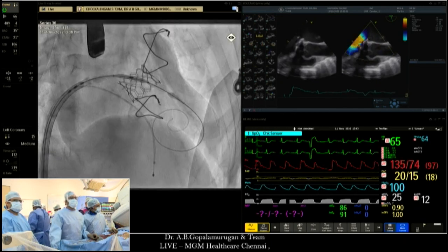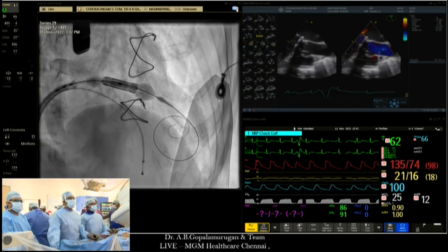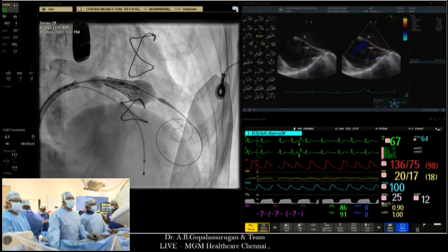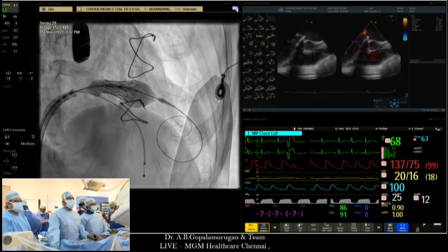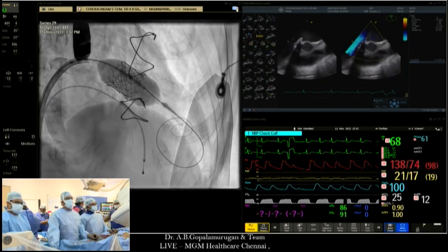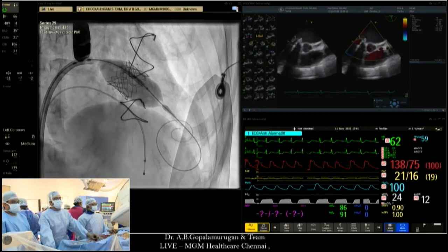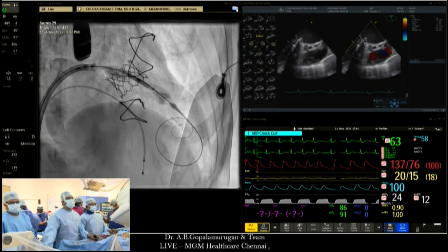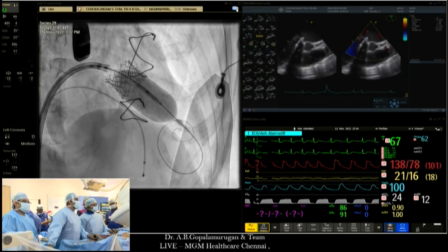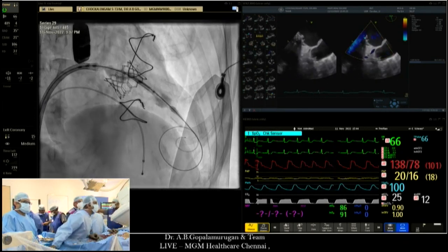This is exactly the technique for valve in ring as well. The valve in ring is even more difficult. At least you are not seeing a stent post here, but there is a stent post. In valve in ring, there is nothing. It's only a ring. So it's exactly the same technique. You start inflating, keep it at 50%. It will try to dive in. You just bring it back. But the last 10 to 20%, you push it to the roof. See that? And that's exactly what he's doing. And once you pushed it to the roof, complete contact. And if you are not satisfied, you have not created an LV flare, in three chamber go back to the same balloon inside and create an LV flare.